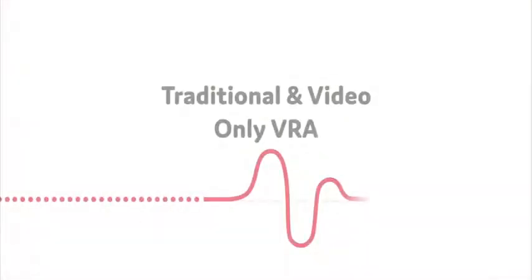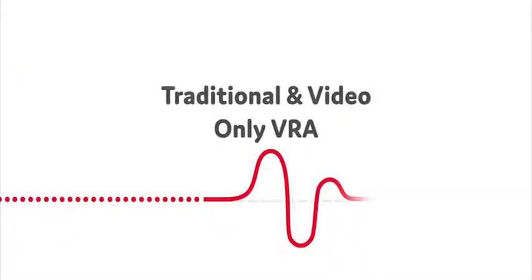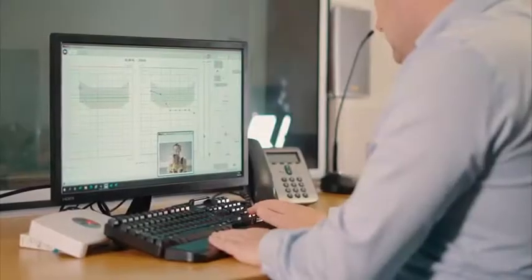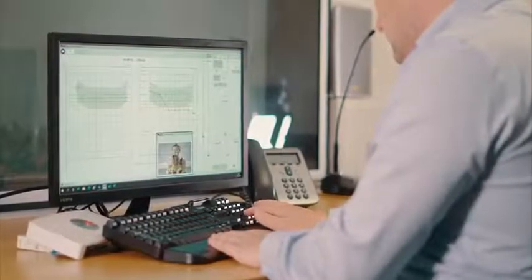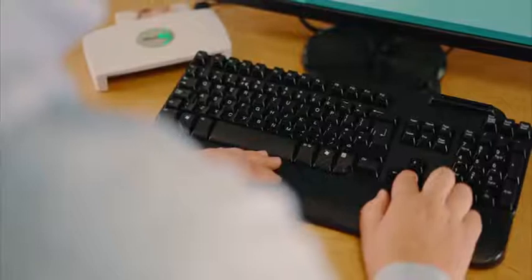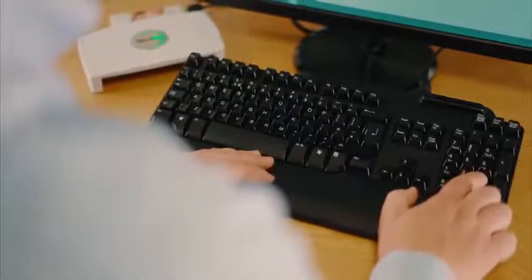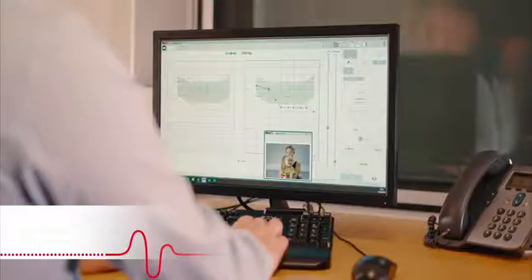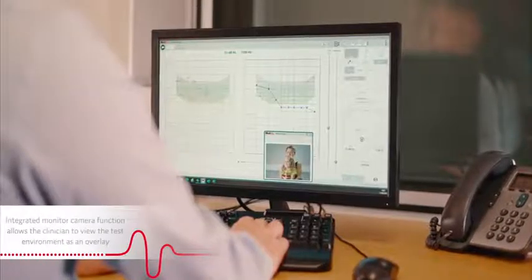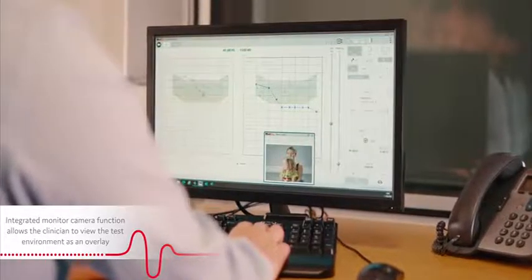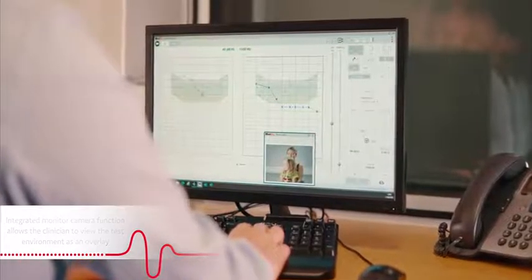The MedRx Studio software still allows for more traditional VRA operation. Full control of the stimuli and rewards can be performed from a computer with MedRx hardware connected. We have integrated a monitor camera function which allows the clinician to view the test environment as an audiogram overlay.